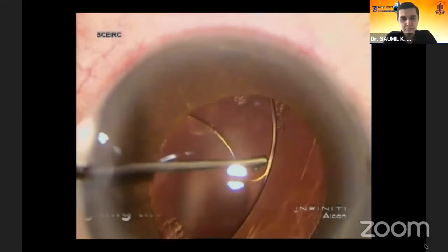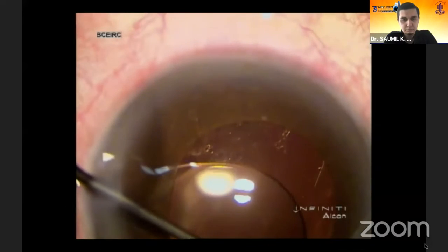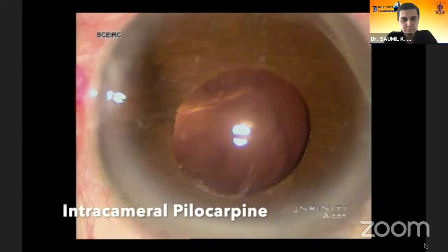After injecting OVD, the lens is aligned to the center in the sulcus. Pilocarpine is injected to constrict the pupil.